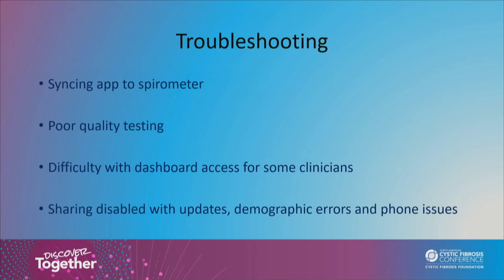So some of the troubleshooting items when it comes to dealing with Bluetooth electronic devices: getting the app and the spirometer to sync together could pose some problems. In the initial versions of the app, there was some difficulty with that. Poor quality testing. This is a big one in the pediatric world, especially as we got through subsequent waves of orders where we picked patients whose primary barrier may have been that they're not good at doing PFTs. They're not good at doing them in clinic with a clinician, so they're really not good at doing them at home on their own.